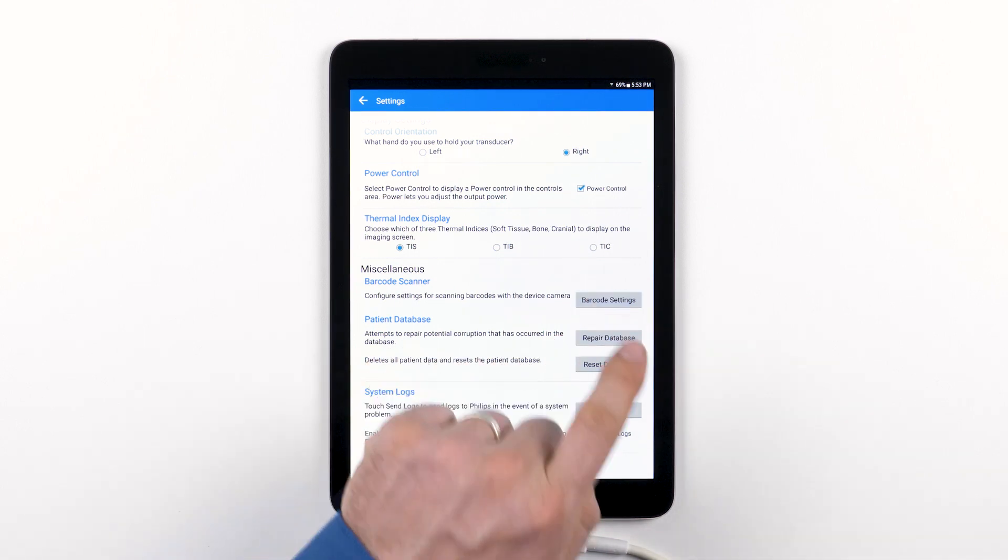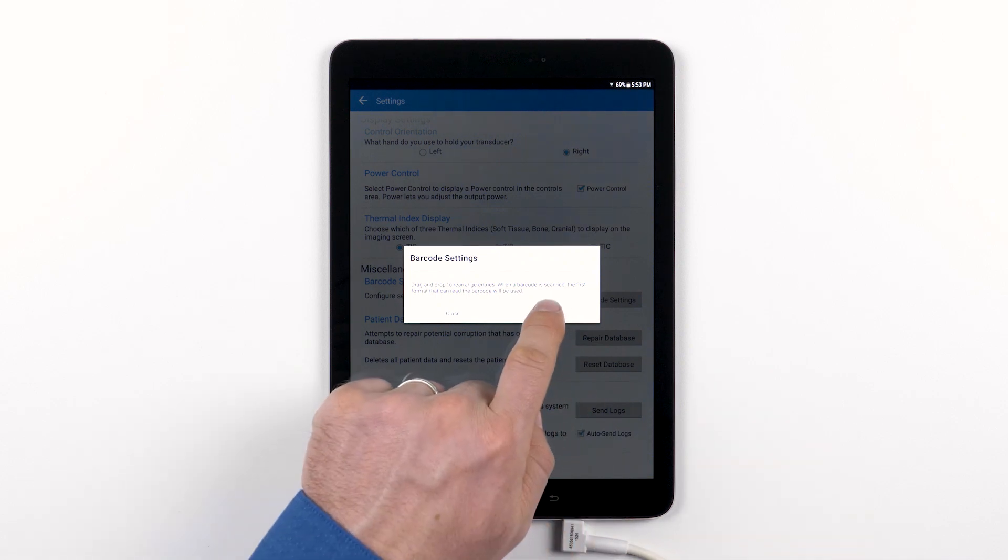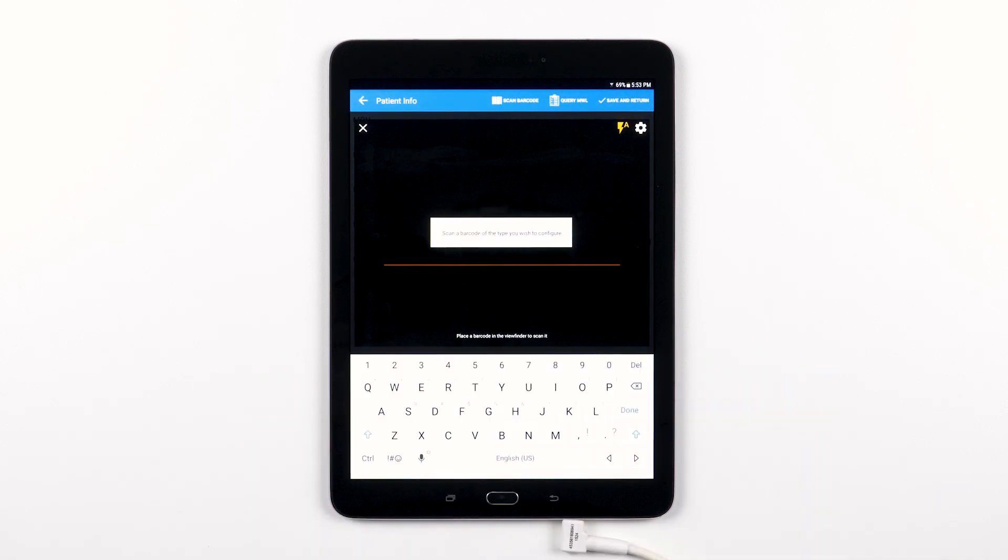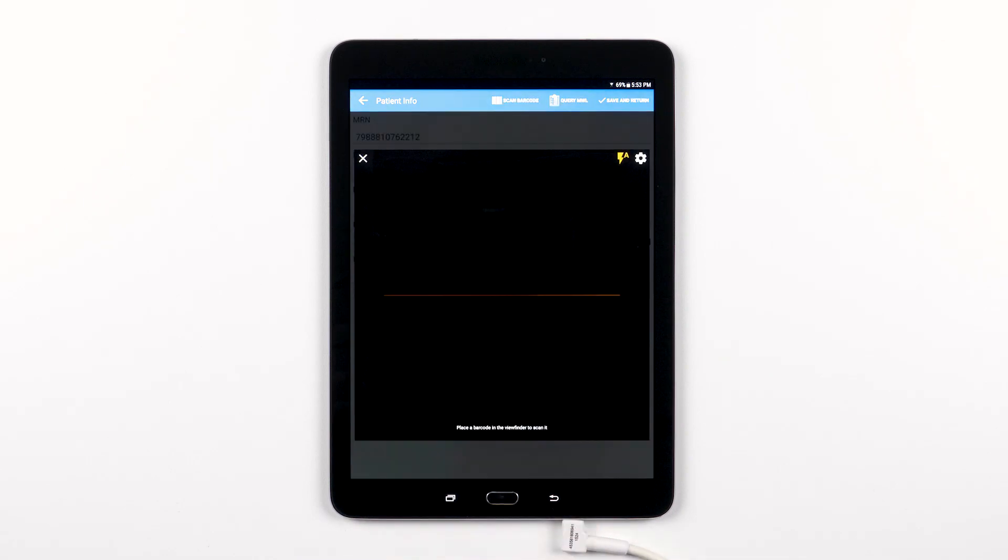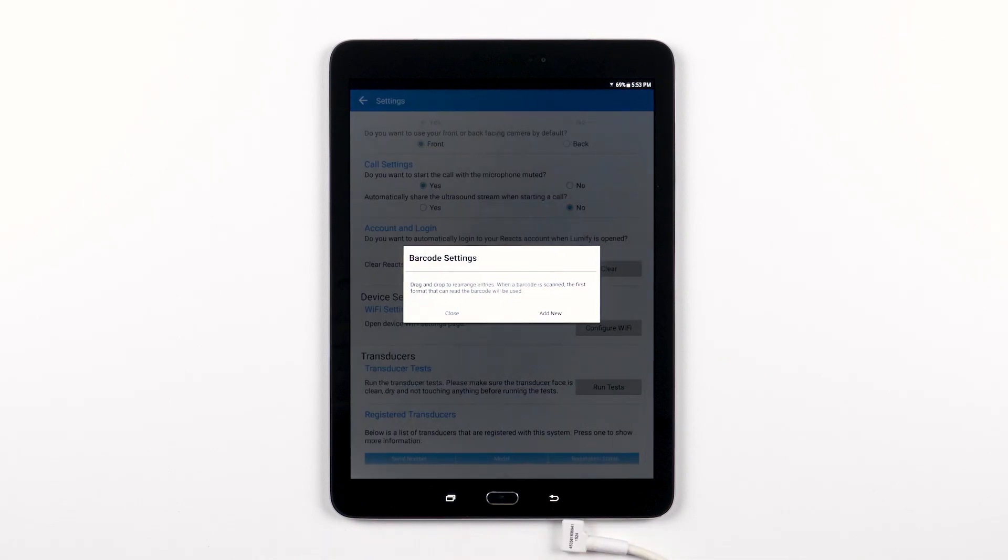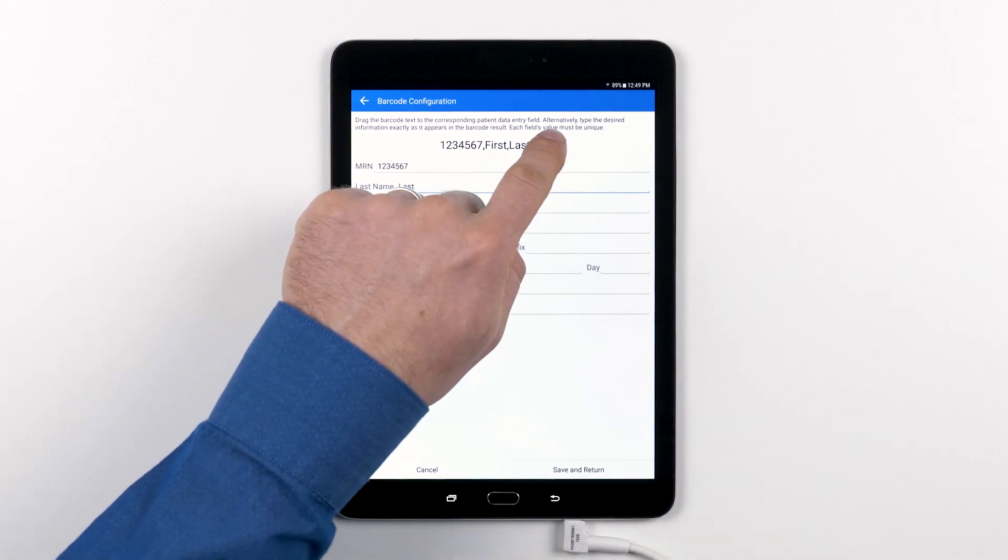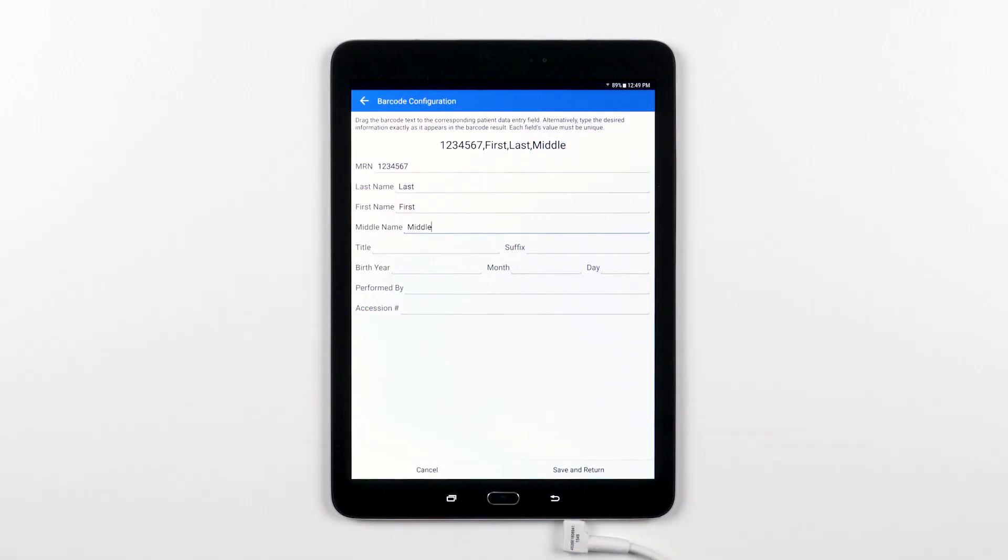If you hit the barcode settings option in the barcode scanner section, you will be able to take a look at your existing barcode settings and add new barcodes to your system. With Lumify, your device's camera is your barcode scanner and it's easy to train Lumify to recognize your institution's barcodes. Simply tap add new and then drag and drop to arrange the entries into the correct fields.